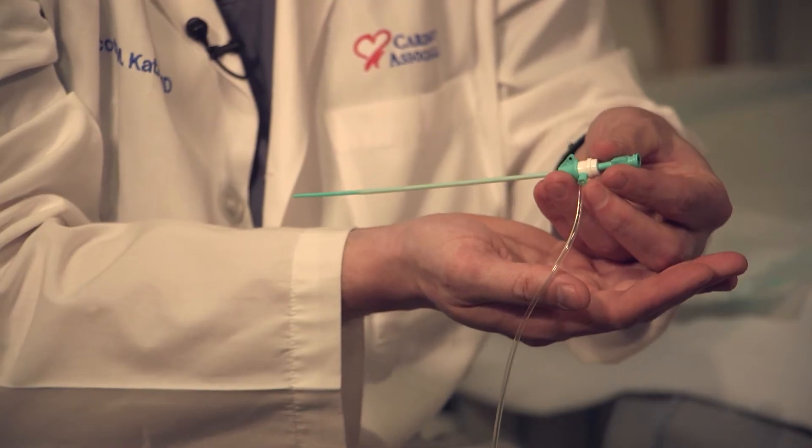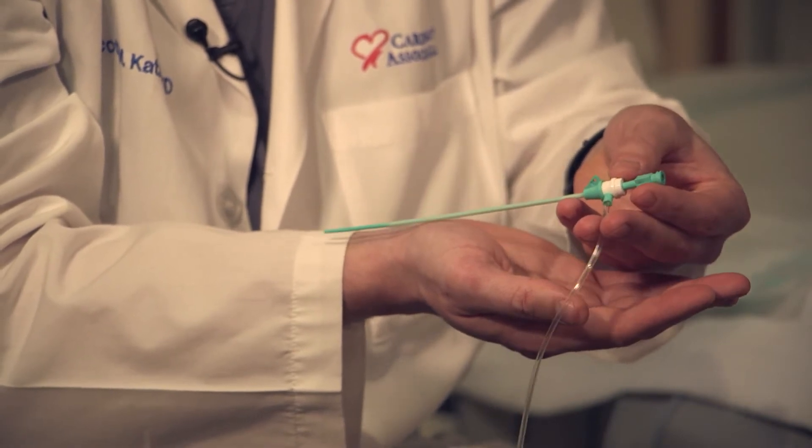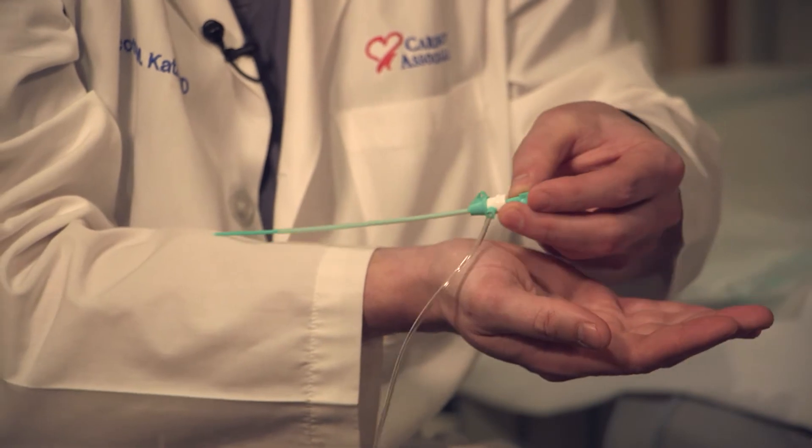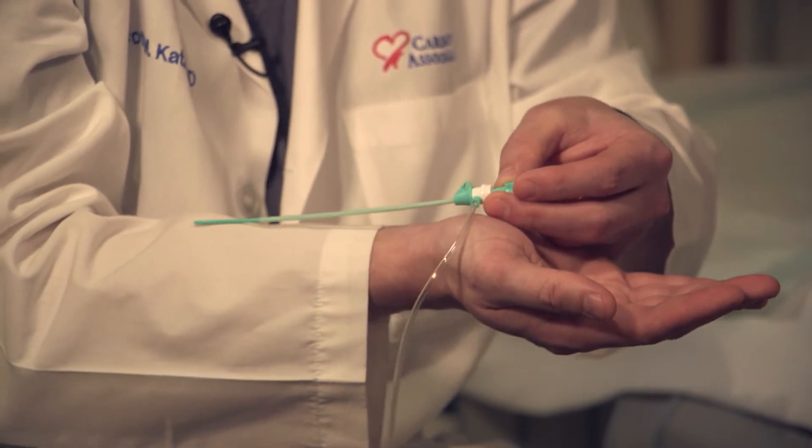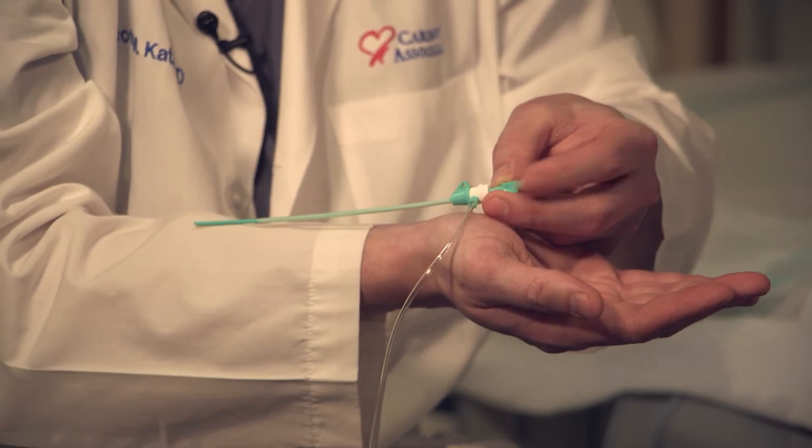This first piece of equipment, once we have the patient sedated, is called a radial sheath. It's a small tube that goes inside the radial artery, and this is where we can pass all of our equipment to get up to the heart and do what we need to do. So this is piece of equipment number one.